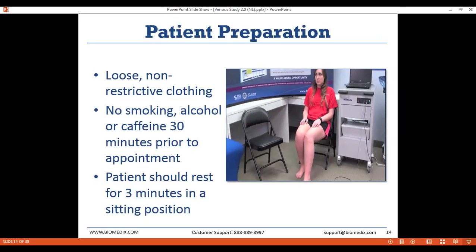You're going to want the patient perched on the edge of the chair, their body perpendicular to the ground. The testing leg — by default the patient's right leg first — should be extended at a greater than 90 degree angle, somewhere between 90 and 120 degrees. The left leg should be at about 90 degrees, with both feet parallel and toes pointing straight forward. This position is preferred because we want to get as much pressure off the patient's veins as possible — a lot of the veins run up the back of the leg, and pressure there prevents blood flow evacuation toward the heart.